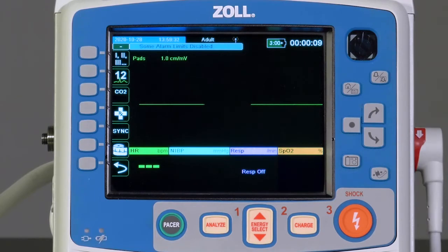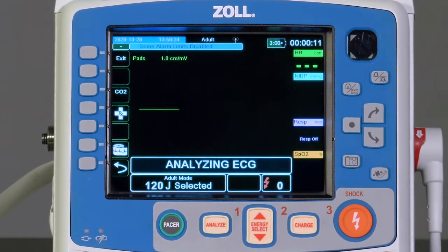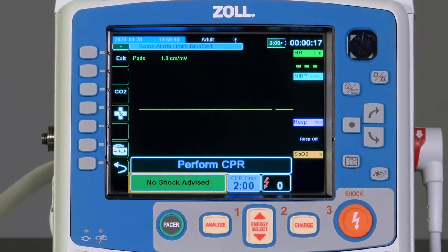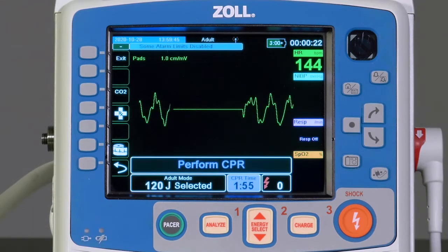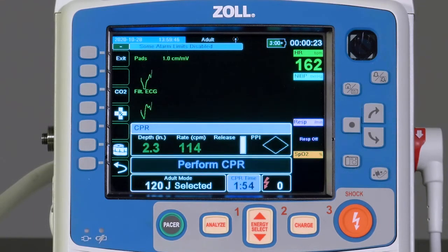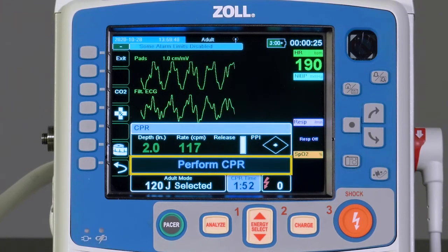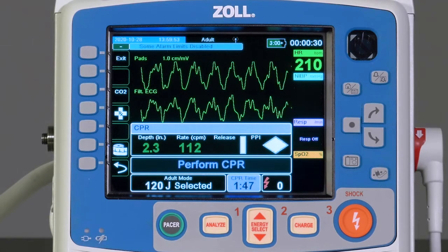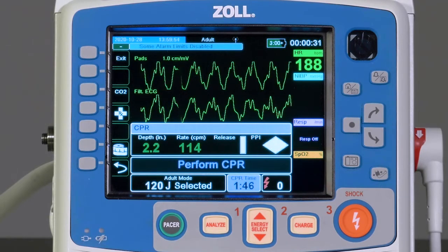At the end of the analysis, an audible 'no shock advised' or 'shock advised' will be heard, as well as text on the screen. If the device indicates no shock advised, the 'perform CPR' message will be displayed and heard audibly. Resume chest compressions.